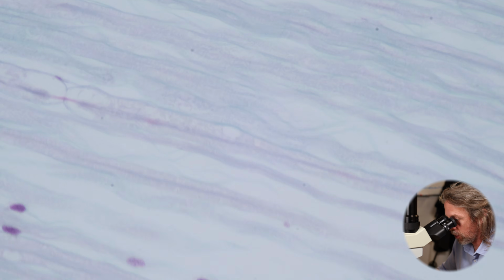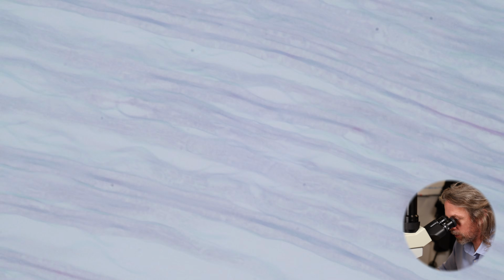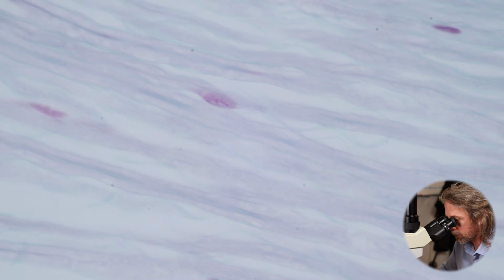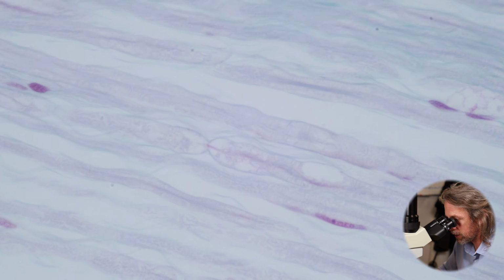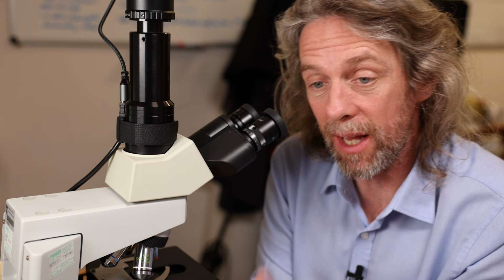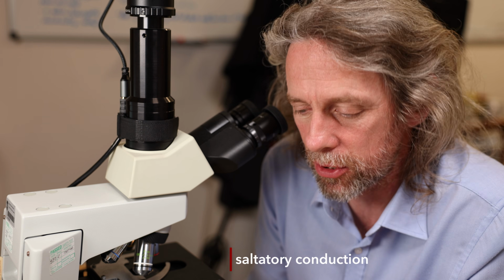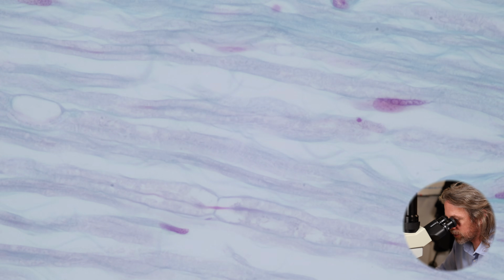Now, because of the plane of section, there's no way if we follow this along we're going to see the next one, because it's just going to run out of the plane of section. Oh, but there's another one there. We could pretend that's the same neuron, but it's not. Can you see it? But we get an idea, don't we, if we run along the length. There's another one. That description of action potentials jumping from node of Ranvier to node of Ranvier to node of Ranvier is known as saltatory conduction.